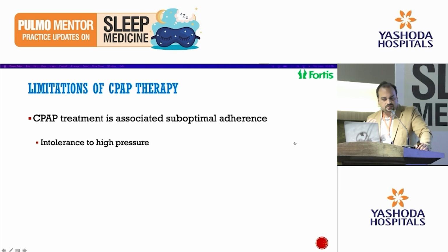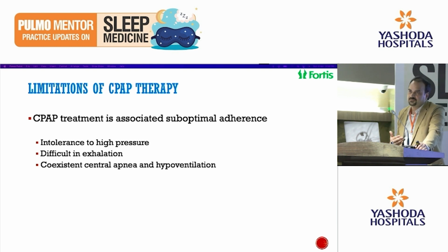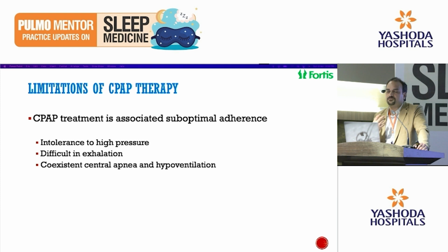And there are limitations of sleep therapies also. CPAP treatment is most of the time associated with suboptimal adherence. The most common reasons are high pressure, difficulty in exhalation, and coexistent central apneas and/or hypoventilation, which are being overlooked. So the patient does not feel comfortable or does not get full relief. That's why the patient is noncompliant to this therapy.